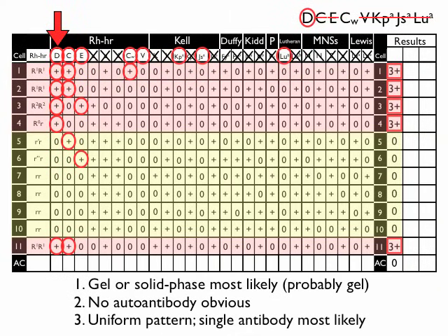And here's an example of that. You've seen this panel before as well. And this panel was one, I beg your pardon, this is actually the first panel where we had an anti-D, but we don't necessarily know that we don't have some of the other ones. In other words, we haven't achieved a level of certainty with anti-big C because we've only got one situation where anti-big C is there and we have no reaction. And the same thing is true with anti-big E. So you've got more work to do. You would choose some selected cells and you would do that work and finish it up.